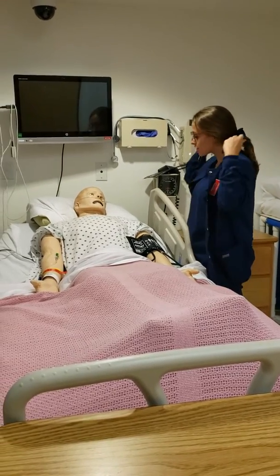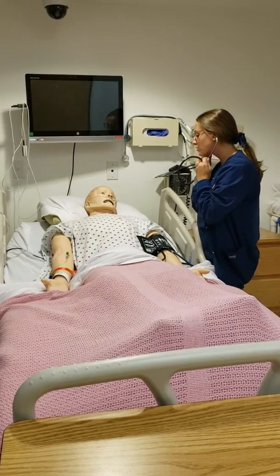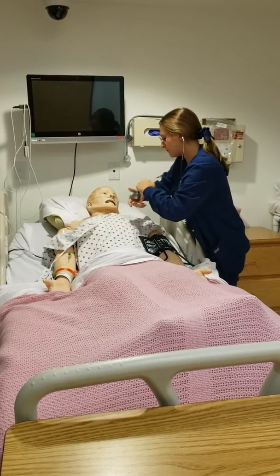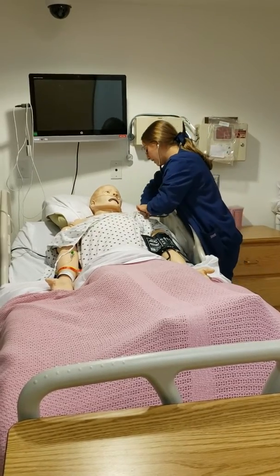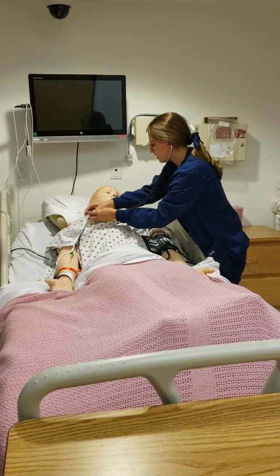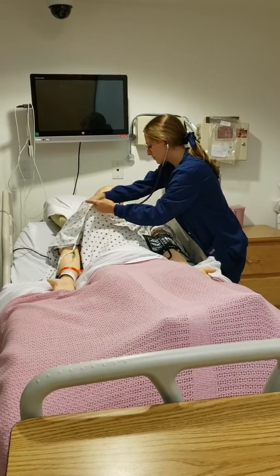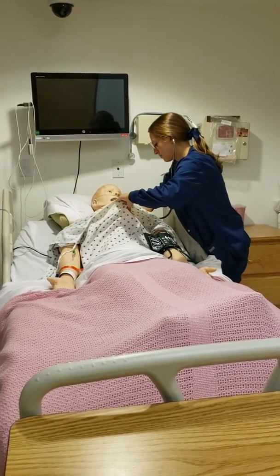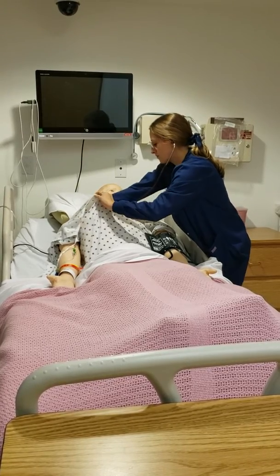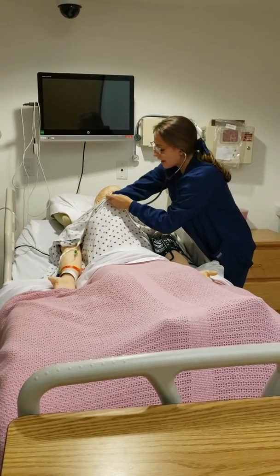Next, I'm going to move on to your thoracic area, which means your chest. I'm going to listen to your lung sounds. First, assessing your anterior lung sounds. And I will check bilaterally to ensure that they are equal. Checking all lung fields on both sides. I would also assess the lateral lung fields.